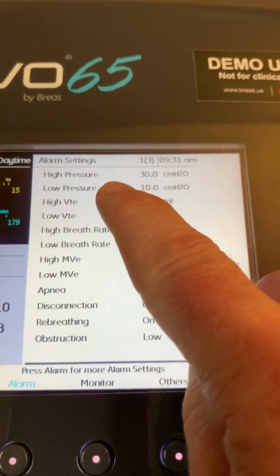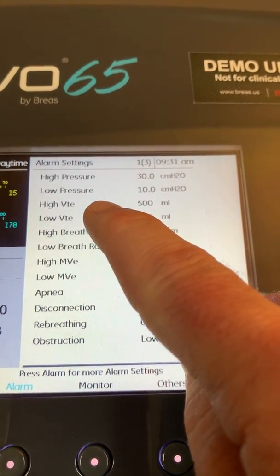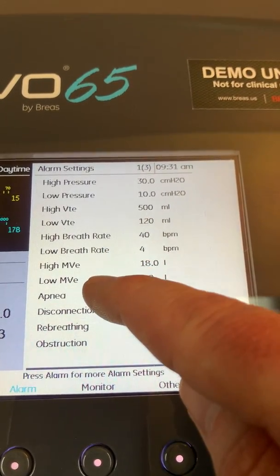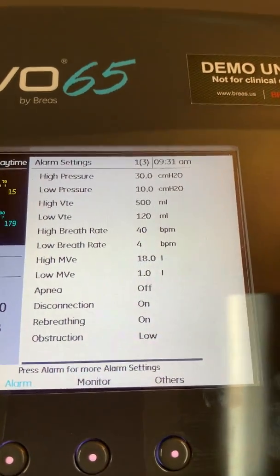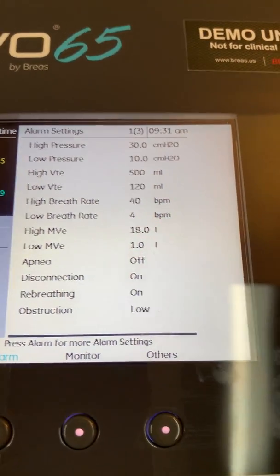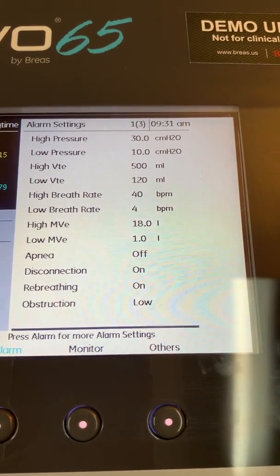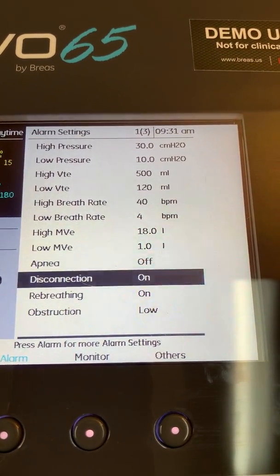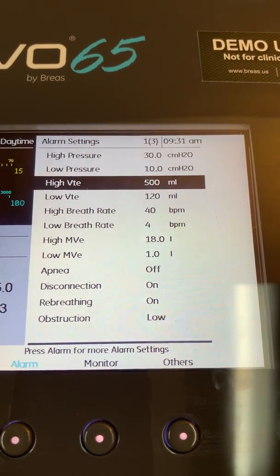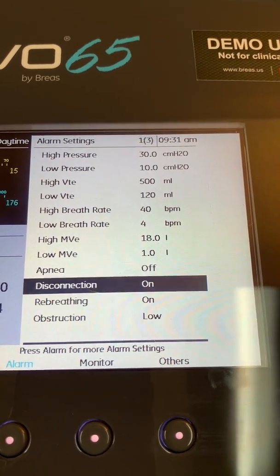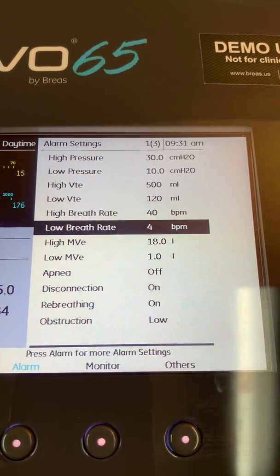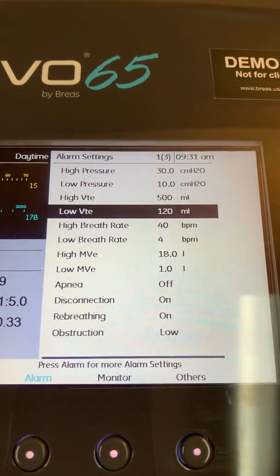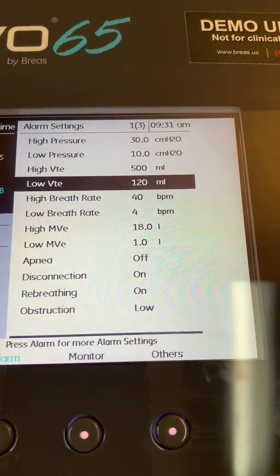You'll see that I have a high pressure, low pressure, high and low tidal volume, high and low respiratory rate, and high and low minute ventilation. Navigation through the alarm menu is not unlike the other two menus — the mode menu and the setup menu. You simply highlight the parameter you want to change by moving down from the top or up from the bottom, and then increase or decrease a value as desired.